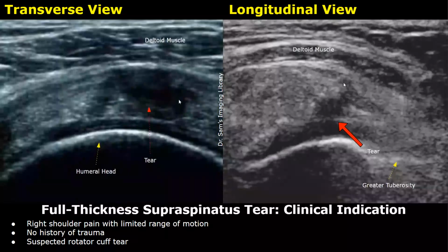This is a case of full-thickness supraspinatus tear. The clinical indication is same, limited range of motion, and no history of trauma.